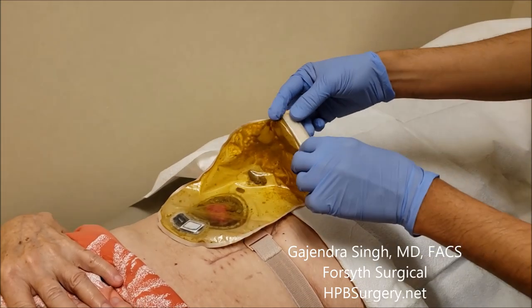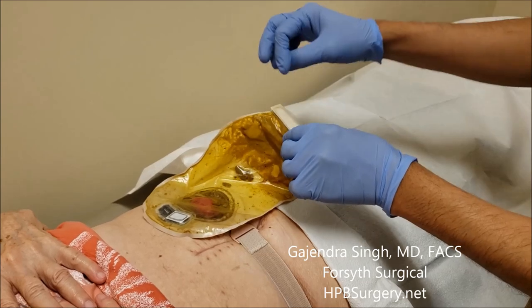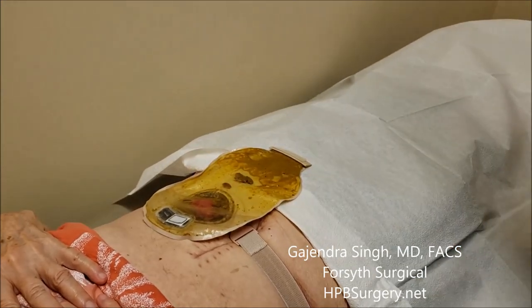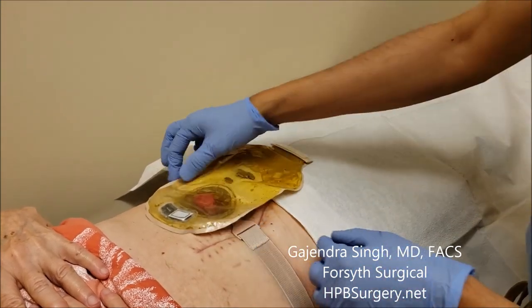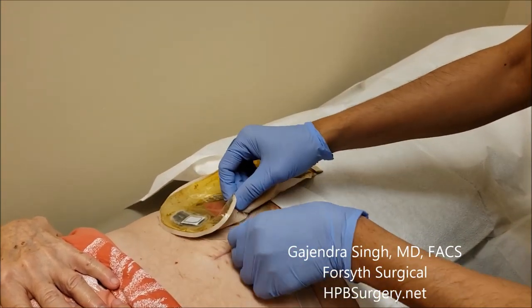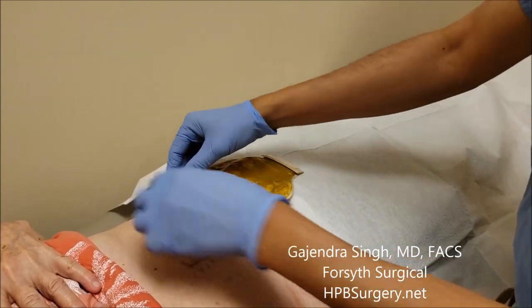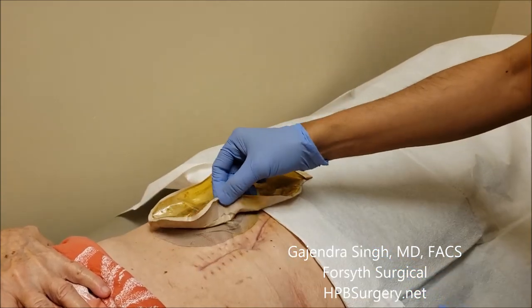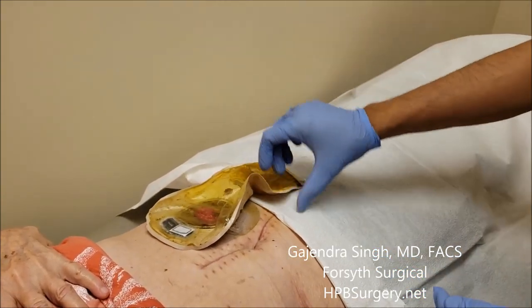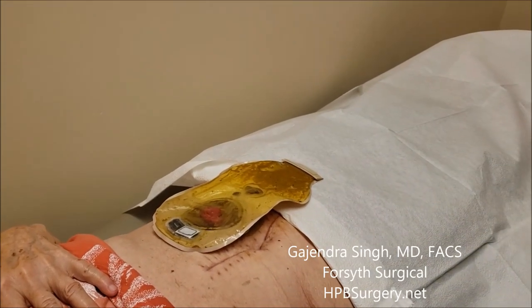This is the roll-down part. If you just need to empty the bag, you can unroll it and empty it. But today we're changing the bag completely. The bag comes with plastic tape on both sides and hooks — you take the hooks out, the belt comes off on both sides, and now it's completely free.